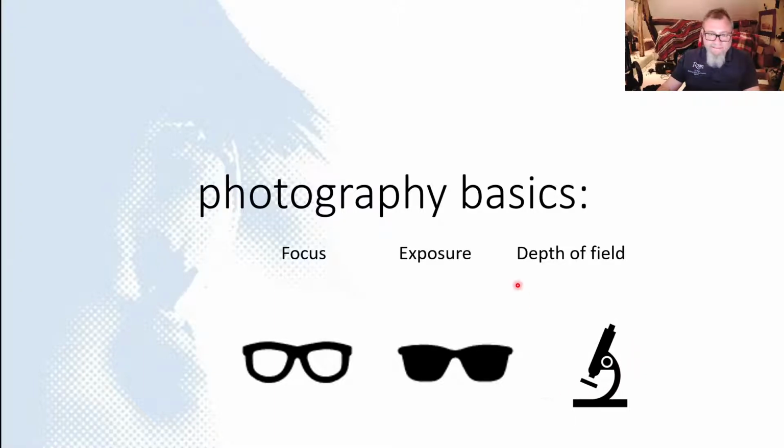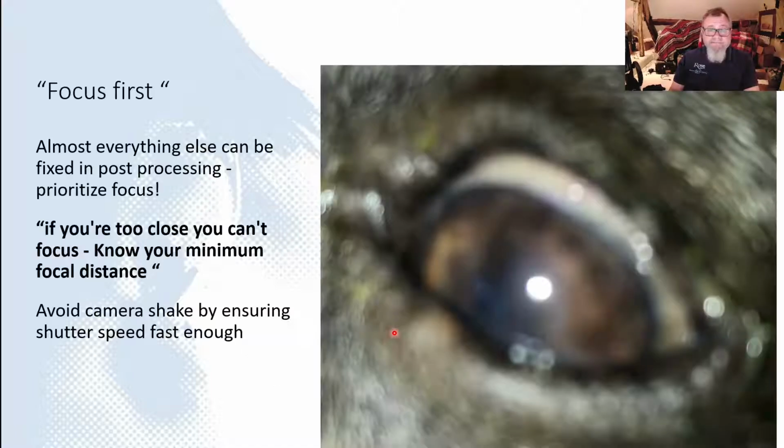So that's an intro as to what we're hoping to achieve. Before we actually go into the technique itself, we're going to run through some photography basics. We'll chat about focus, exposure and depth of field, and see if we can get the hang of those concepts, which will help us take more useful images when we get to our patients.